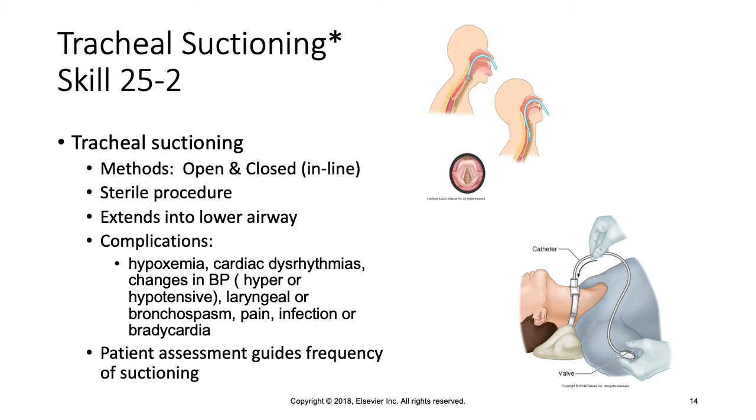Oftentimes patients will tell you it can be uncomfortable. It shouldn't be painful, but maybe uncomfortable. But if they've had it for a while, they'll tell you that they need to be suctioned, or they will motion that they need to be suctioned.